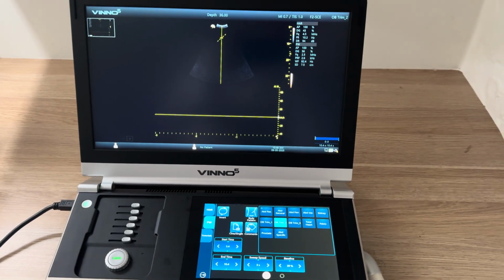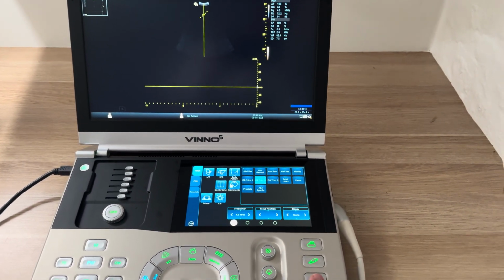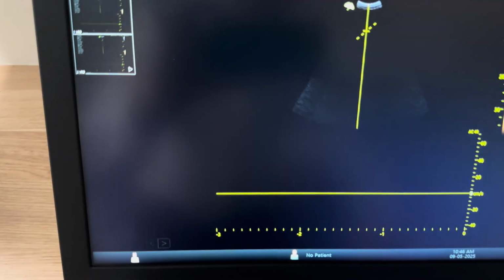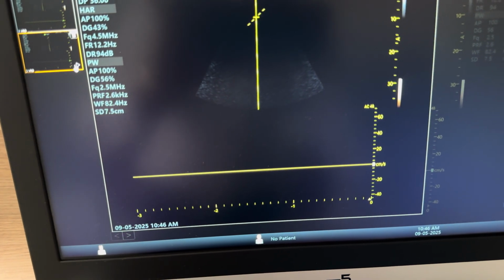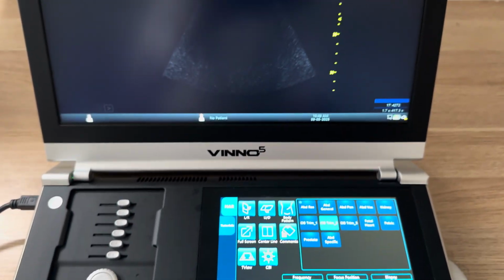And if we want to save a cine loop, you just do your live imaging. So we're live imaging at the moment, and I'm going to press save, and that's going to give me a video or a cine loop. It usually takes the last 5 seconds. See how it's got the play button there, that's a video. You can change that in your system settings, so I'll show you where we can change that.